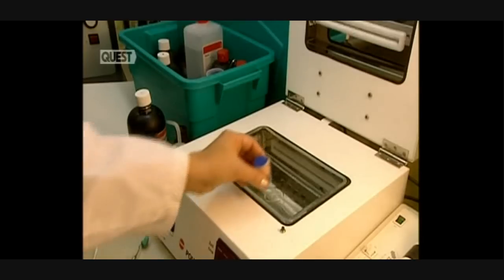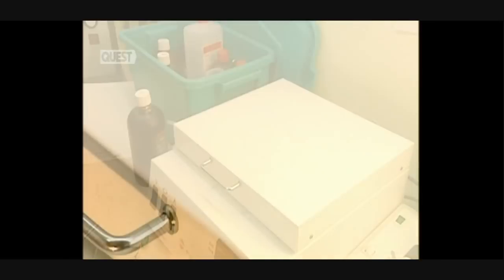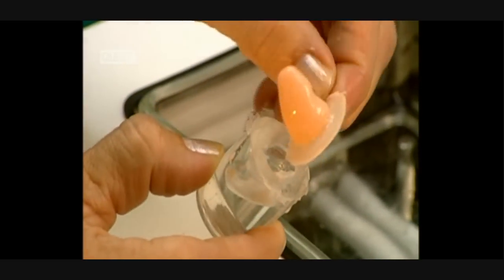Acrylic is poured into the mould before placing it into this ultraviolet oven. Without emitting any heat, this oven hardens the acrylic. At this point, the raw prosthesis is without its electrical components.